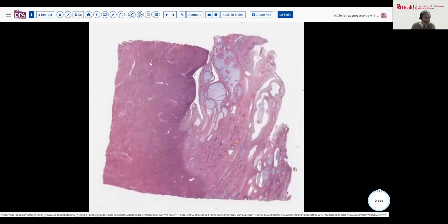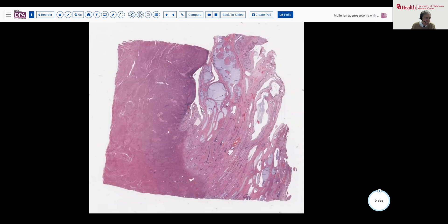The patient came to hysterectomy and the sample was opened, revealing this rather broad-based polypoid structure in the endometrium arising from the endometrium and lower uterine segment. And here you can see what at low power looks very much like a fairly typical endometrial polyp. So, is that where we should stop?